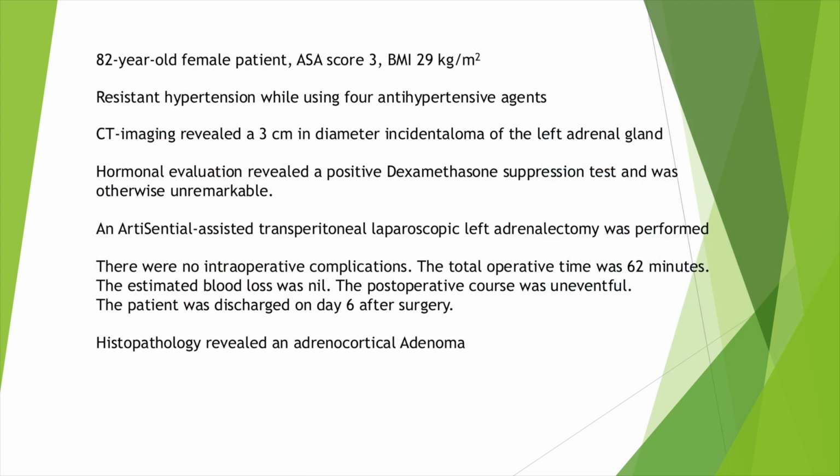This case involves an 82-year-old female patient who presented with an incidentaloma of the left adrenal gland. While the dexamethasone suppression test was positive, the tumor was otherwise endocrinologically inactive. We proceeded with an ArtiSential-assisted transperitoneal adrenalectomy in accordance with the MDT recommendation. The procedure was completed without intraoperative complications and the patient's postoperative course was uneventful.